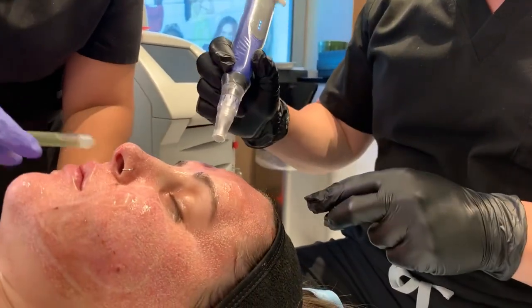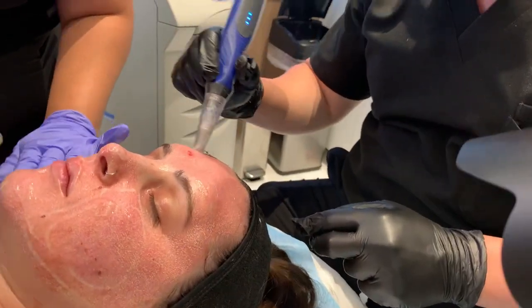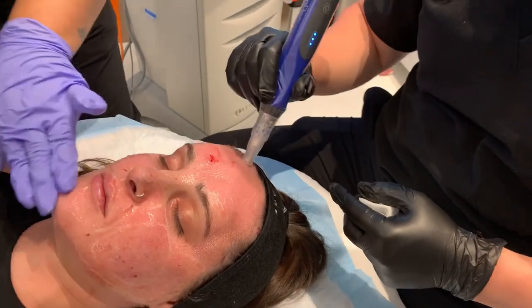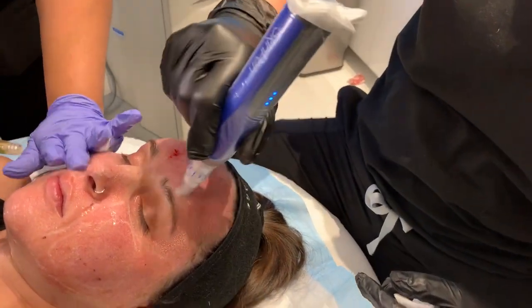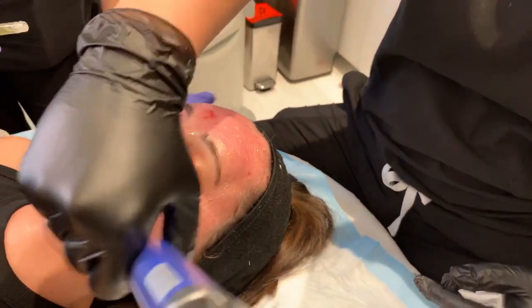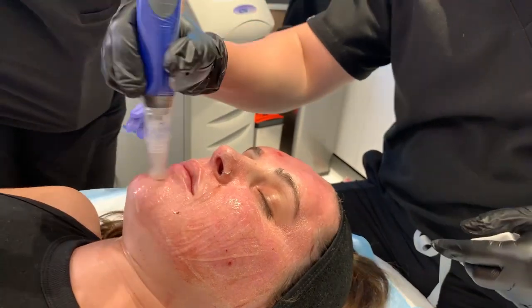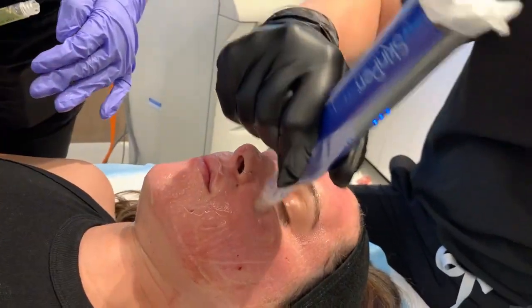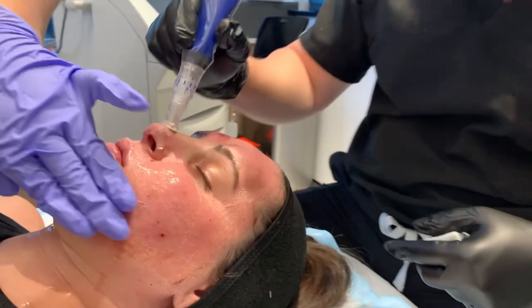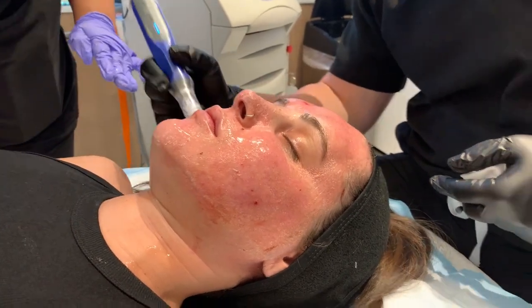And now we microneedle. So she's going to get maybe a little bloody on this. But this is pushing the PRP, this is pushing in the Hyla B and the hyaluronic acid from Emerage Skin into the skin, along with our barrier gel. And I was one of the first people to do these types of combinations where we combine these treatments, and the results are much better than if you don't do this with the lasers. It just doesn't improve the results.